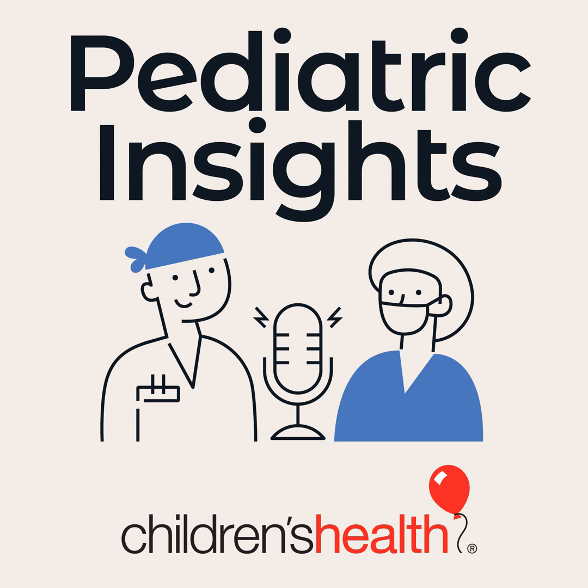When we look at all the studies on fetal MRI imaging and their safety, MRI is a radiation-free type of imaging. And we prefer to do this in the third trimester, but the studies have shown that because it's radiation-free, we have limited amounts of risk to the mom and baby. We make sure that the heating that can be associated with MR imaging is limited. So we take all of that into account so that there's not excessive heating of the fetus, and we operate this at lower levels. We're also taking into account the comfort of the mother and the overall gestational age, which we do in a slightly older gestation.